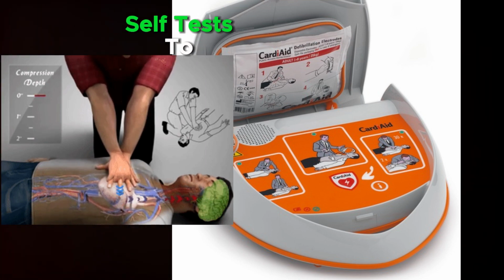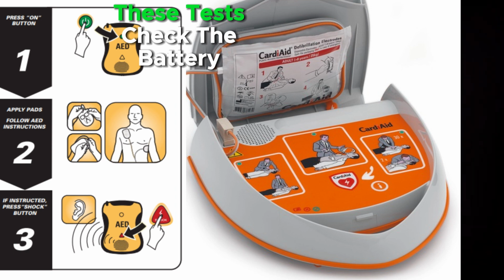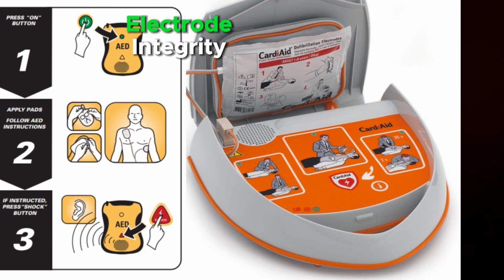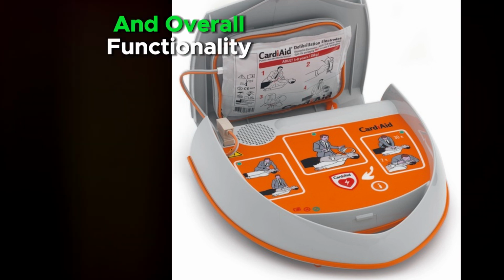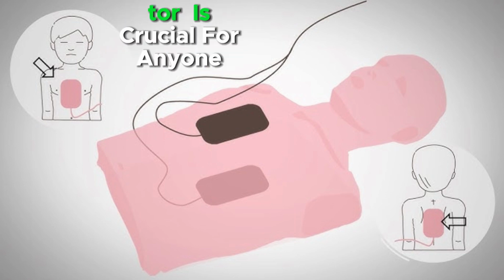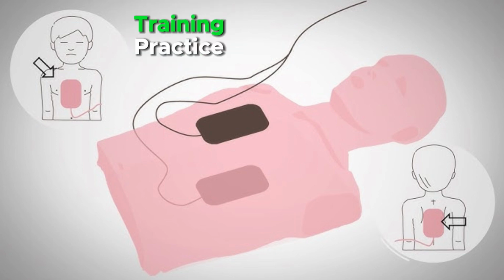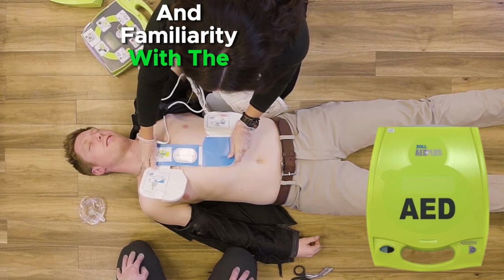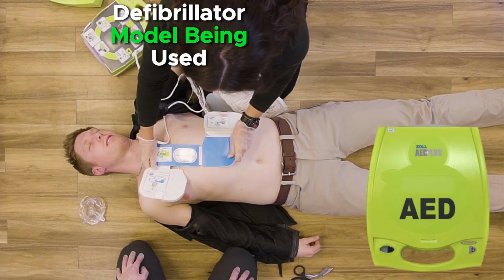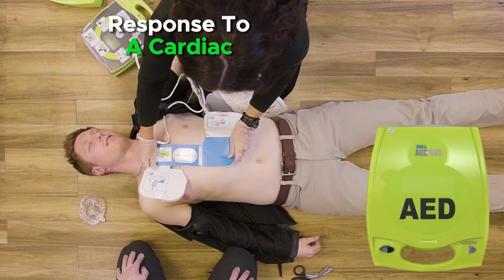Defibrillators undergo regular self-tests to ensure that they are in working order. These tests check the battery status, electrode integrity, and overall functionality. Understanding the working principles of a defibrillator is crucial for anyone tasked with using this device in an emergency. Training, practice, and familiarity with the specific defibrillator model being used enhance the effectiveness of the response to a cardiac emergency.